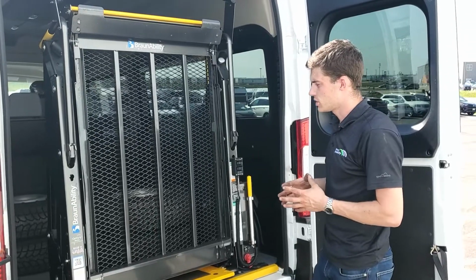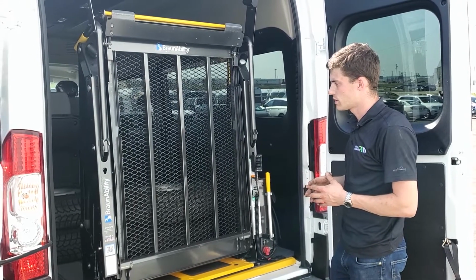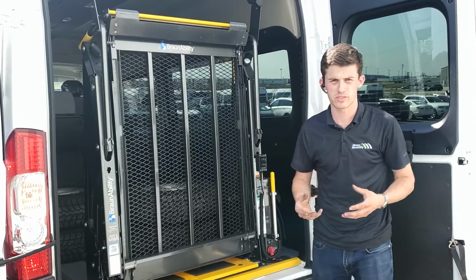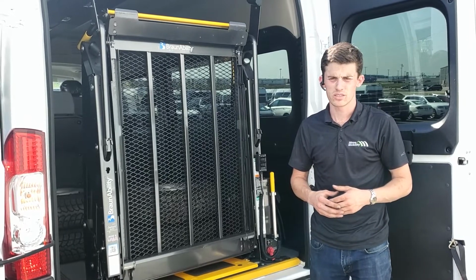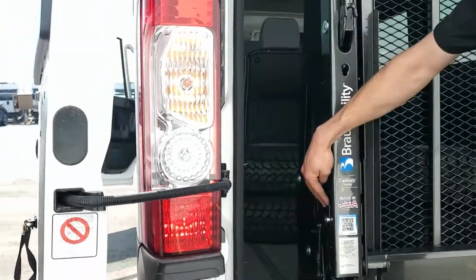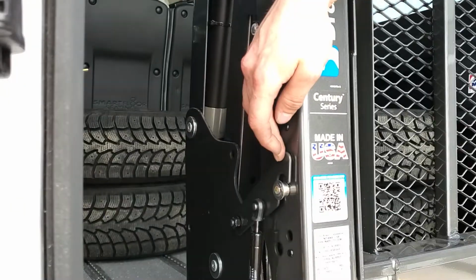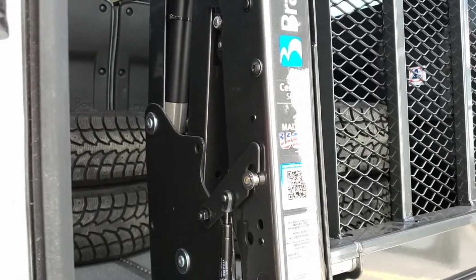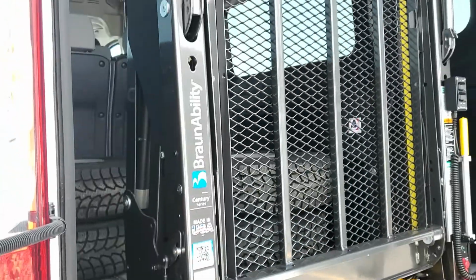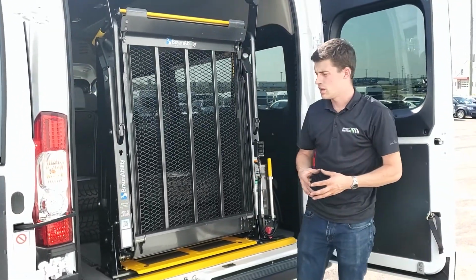First things first, one of the more common things we find is customers will say, well, my lift doesn't come out of the vehicle. And you'll see here on the side of the lift, on both sides, these safety catch hooks. One on the driver and one on the passenger. They're on all Braun Century lifts that MoveMobility installs in their wheelchair accessible full-size van lineup.